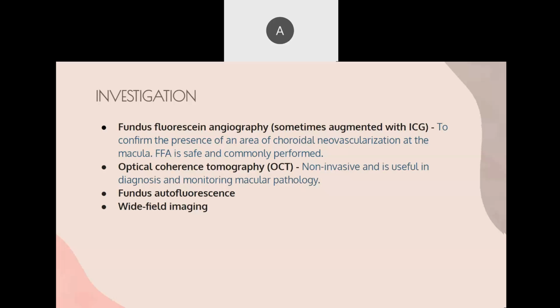First, if a patient comes with AMD, suspected AMD, we will do OCT macula first. OCT macula is best compared to fundus fluorescein angiography. OCT macula is non-invasive. Okay, later at the clinic you all observe there is one machine. It's a very expensive machine. Basically it's like a CT scan, but it is a CT scan at the level of your nerve fiber, at the level of your retina.